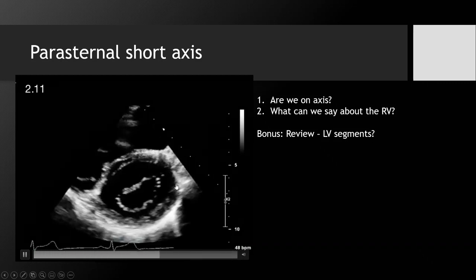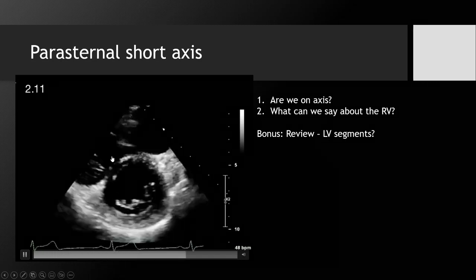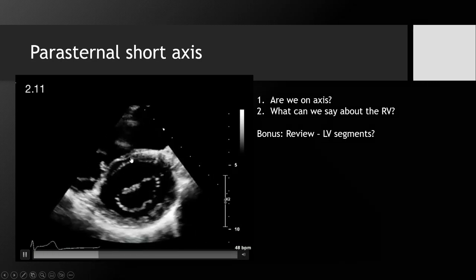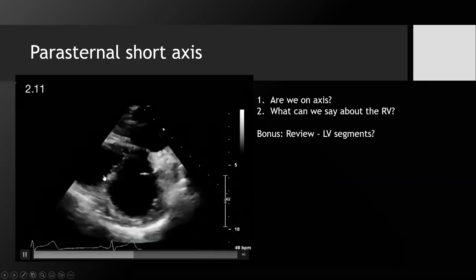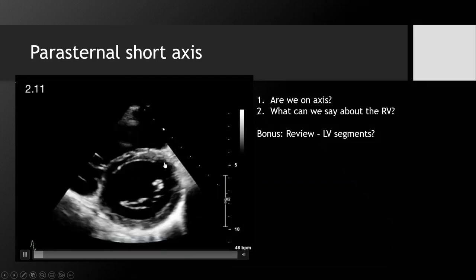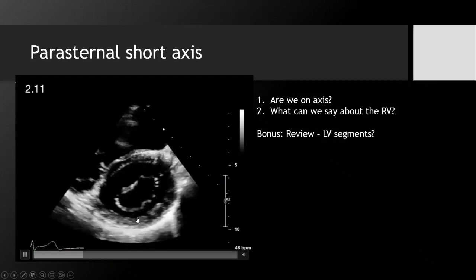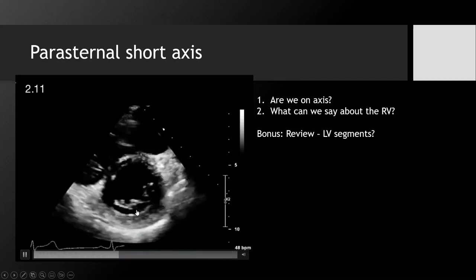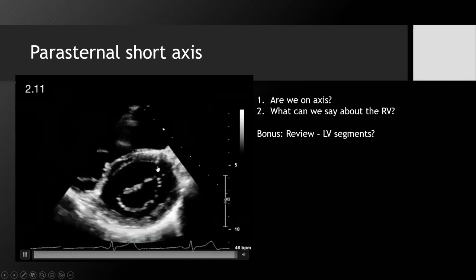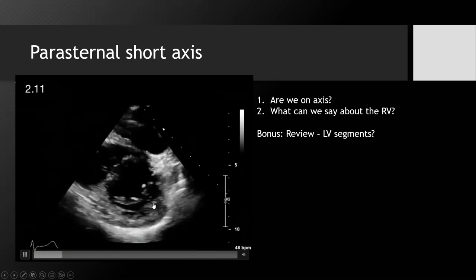This is your lateral wall. And your septal and lateral wall are divided in half, and they're named by whether or not they're anterior or inferior. So you have anteroseptal and inferoseptal, anterior wall, inferior wall, anterolateral, inferolateral. And so that would be how you would name your 6 segments at the basal level. And then if you were at the papillary level, they would have the same names, but you would say at the papillary level.